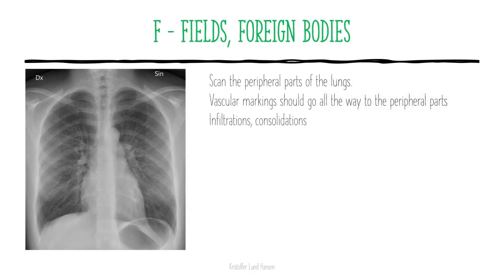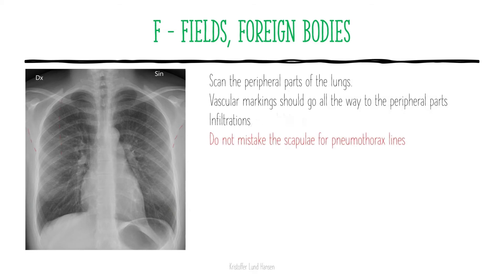F stands for fields or foreign bodies. Fields is one of the more important parts of the chest x-ray examination. You have to scan the whole peripheral part of the lung for any sign of pathology. The vascular markings should go out to the periphery of each lung — if they don't, it is usually a sign of pneumothorax. You can also scan for infiltrations. A very common beginner mistake is looking at the scapula and thinking those lines indicate pneumothorax, leading to a misdiagnosis when the patient is actually fine.